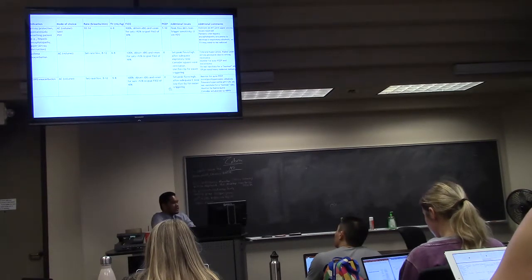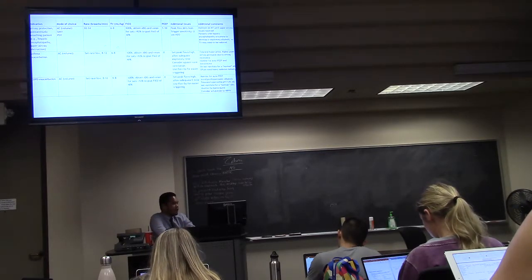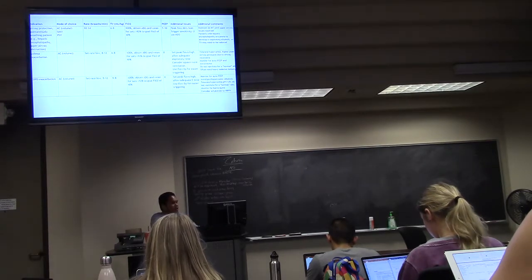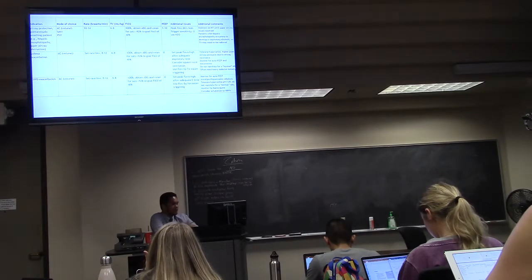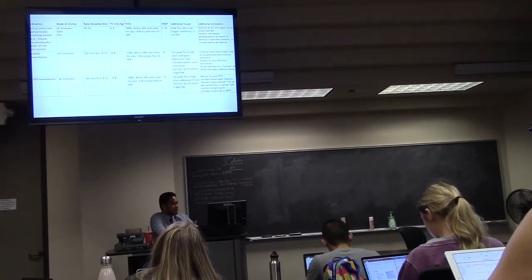Again, trying to emphasize, try to reach a PEEP of less than 5 in patients with asthma or COPD. And again, low tidal volumes and low respiratory rates so that they can exhale their breaths. You can do what's called permissive hypercarbia in these patients, like what the other lecturer was talking about. A lot of these patients, say COPD, are chronically hypercarbic. If you correct their CO2 very quickly, you can make them very alkalotic very fast, so you sometimes need to correct these patients very slowly.